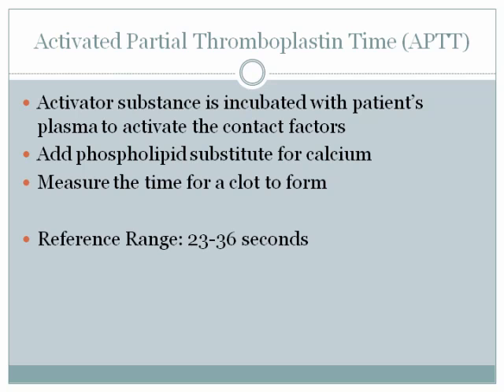Again, you're just measuring the time. How long is it going to take a person's intrinsic pathway to clot? And in this one, it's 23 to 36 seconds. It has a few more steps to go through, so it's a little bit longer.